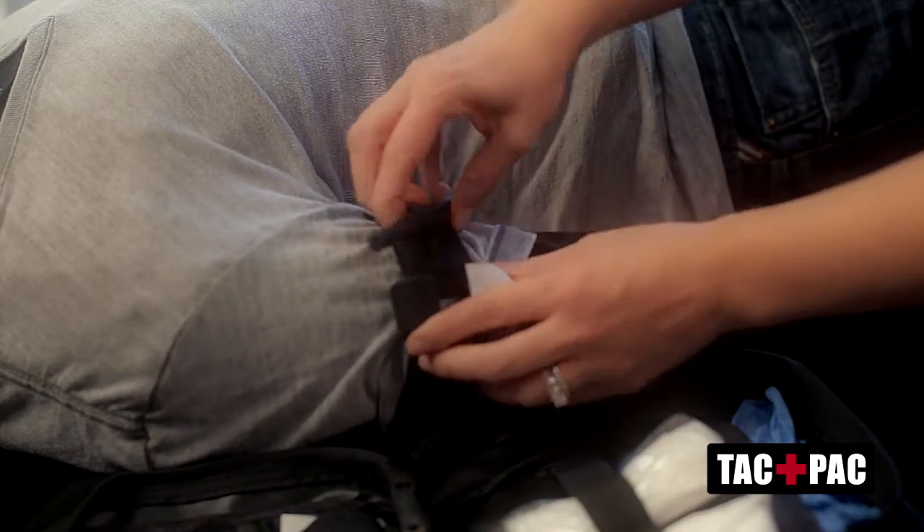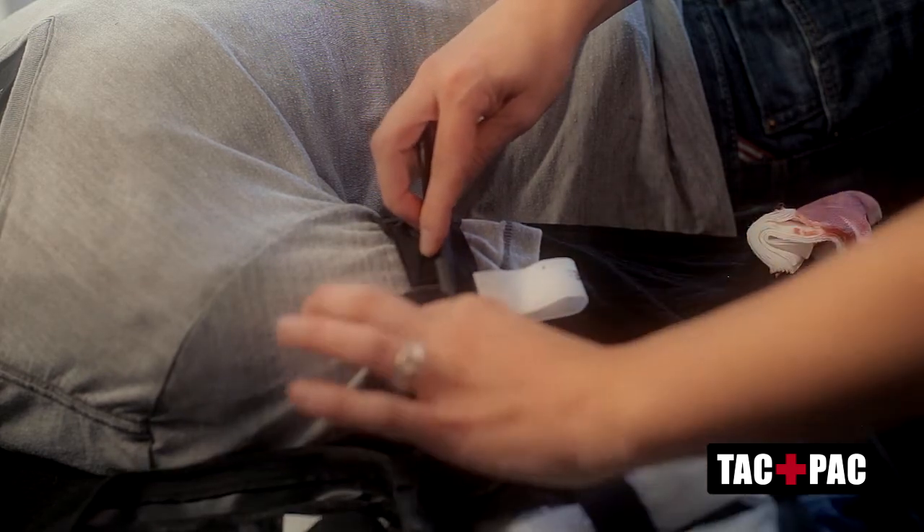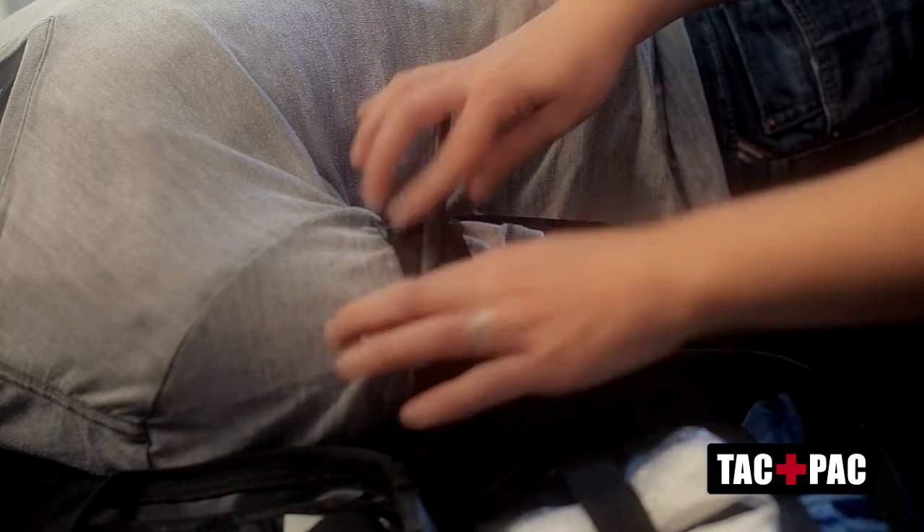Turn the windlass and pull it snugly until the bleeding stops, then lock it into place and apply the cover.